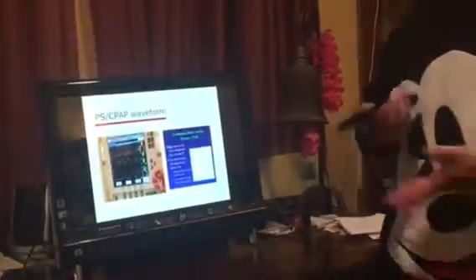And then the pressure support CPAP waveform. Nothing more to it, it's basically the same as the pressure control ventilation waveform. But if you look closely, which we can't really do at this point, when you get the PowerPoint you'll see there's a couple of red marks in the flow pattern.